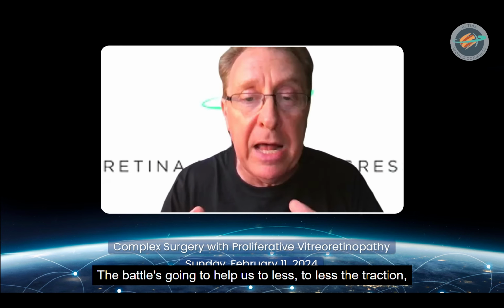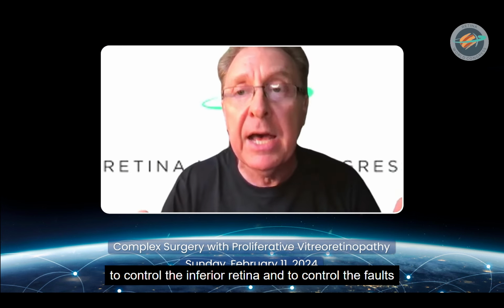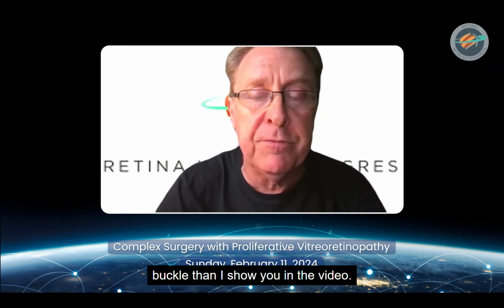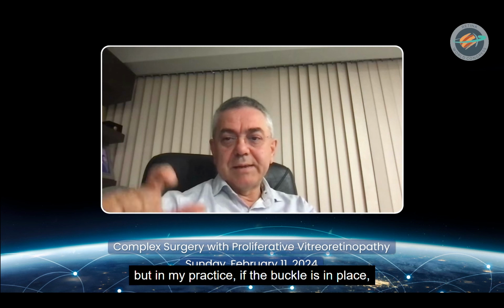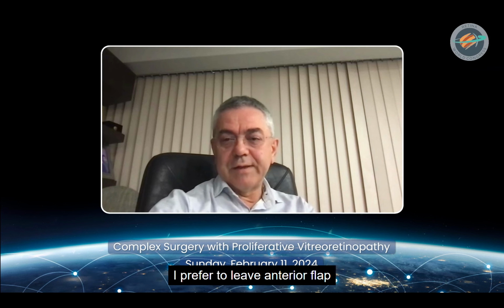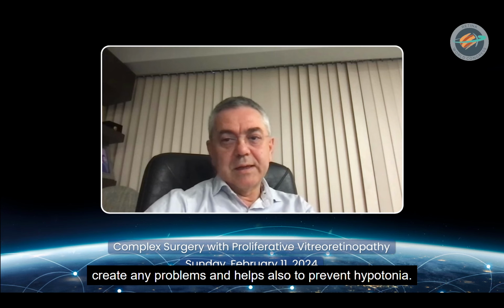The buckle is going to help us relieve the traction, control the inferior retina and the folds, and obviously control the redetachment, and give laser over the buckle, as I showed you in the video. I mentioned the patient with a buckle previously, but in my practice, if the buckle is in place and the anterior flap is attached, even if laser has been done, I prefer to leave the anterior flap, because if the laser has been done, it's attached, it usually doesn't create problems and also helps prevent hypotony.